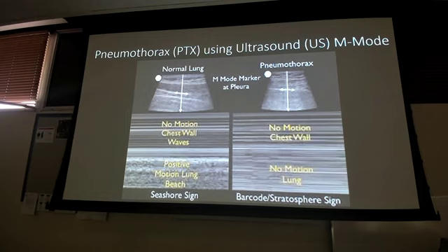area between two ribs and you've put that line, like, hey, this is where I want you to evaluate. I know I'm between the two ribs, evaluate here. You switch to M mode to show that motion, and it takes a picture. So the idea is that the ultrasound is taking a continuous picture of that area, okay?